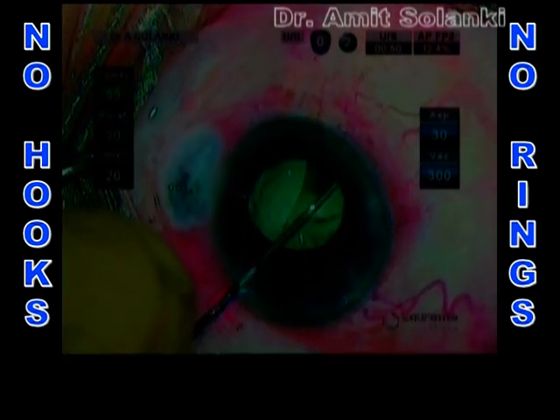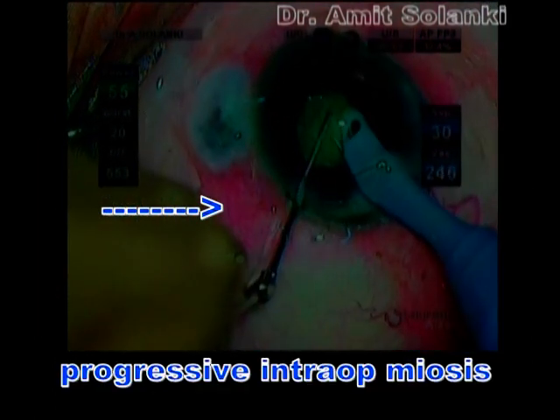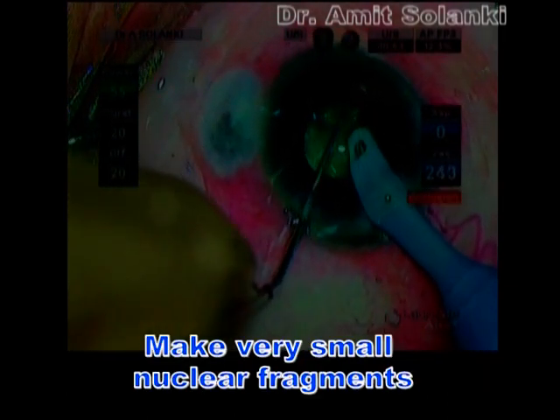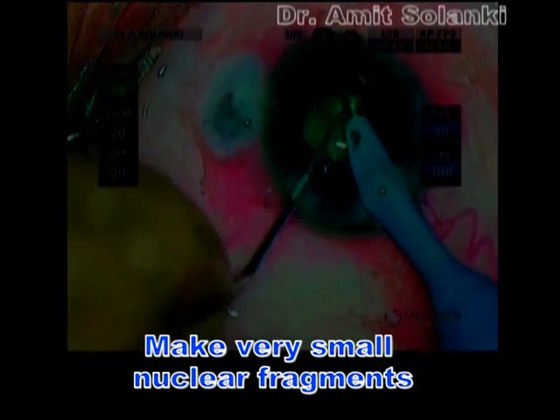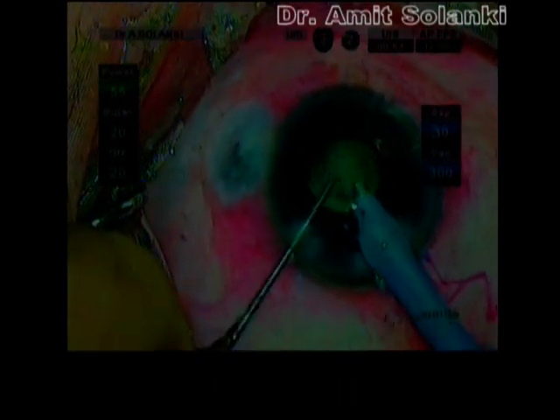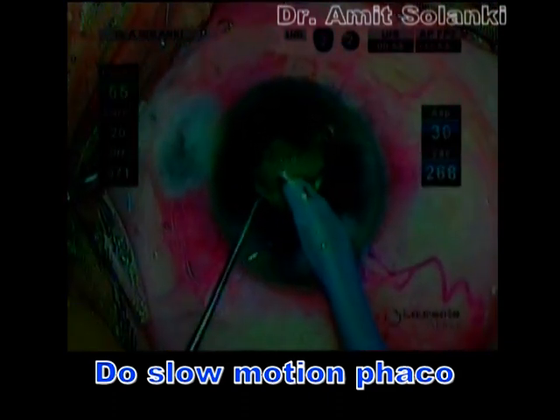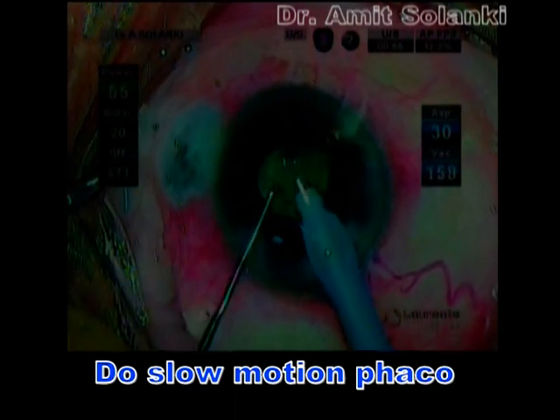The second heminucleus was also divided into multiple small fragments in a similar manner. In such cases, we have to make fragments as small as possible so they can be consumed very easily. The main challenge in such a situation is proper understanding of fluid dynamics and doing slow-motion phaco to prevent inadvertent aspiration of uveal tissue or the posterior capsule.